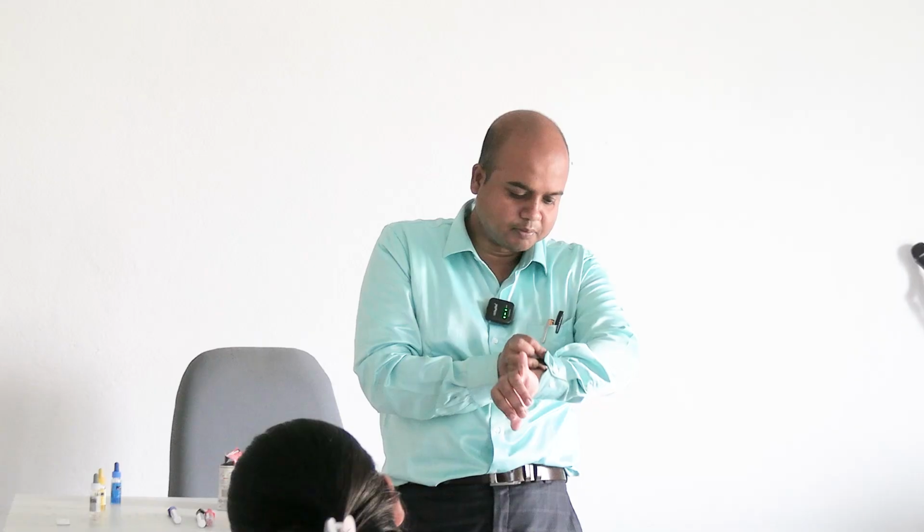It will take maximum 30 minutes, there is enough time. Okay, so do it, and if you do it once, you don't need much practice. This is a very simple thing, you just add antisera and blood and see the agglutination reaction. Only a single class is allotted, not even a whole 2-hour class is required for this. This is a very simple experiment, but remember, from the exam point of view, if you get this one, then you will get an additional experiment. So let's proceed to the lab.